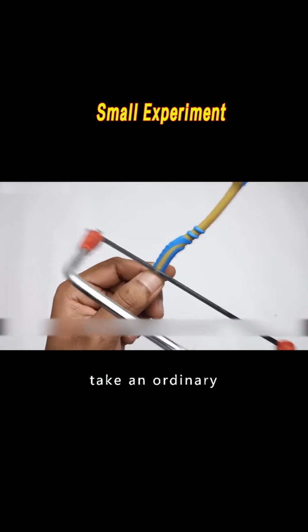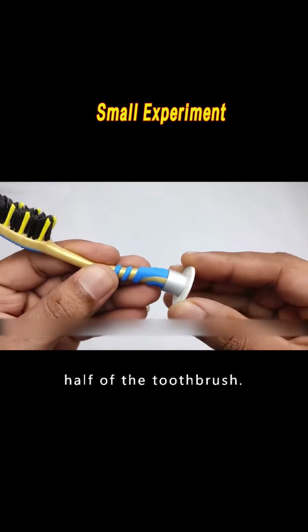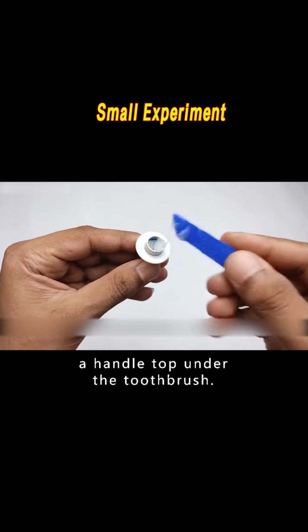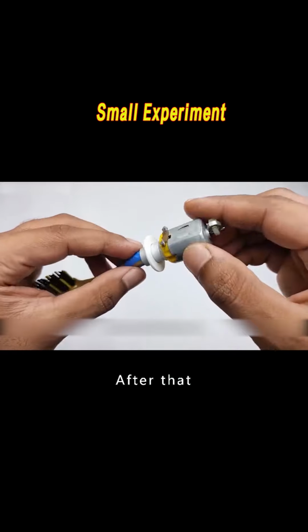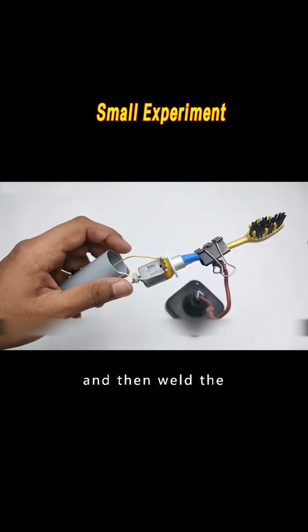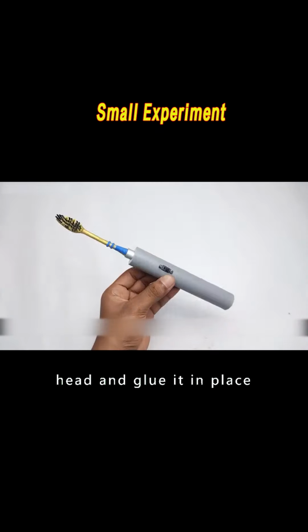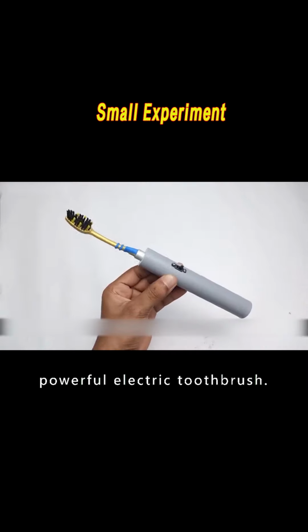Once you're done, take an ordinary toothbrush and use a saw to cut off the top half of the toothbrush. Then put an aluminum tube and a handle top under the toothbrush. After that, daub a little glue on the inside of it, paste the motor on it, and then weld the wire of the motor on it. After welding, attach the brush head and glue it in place, and you have a powerful electric toothbrush.